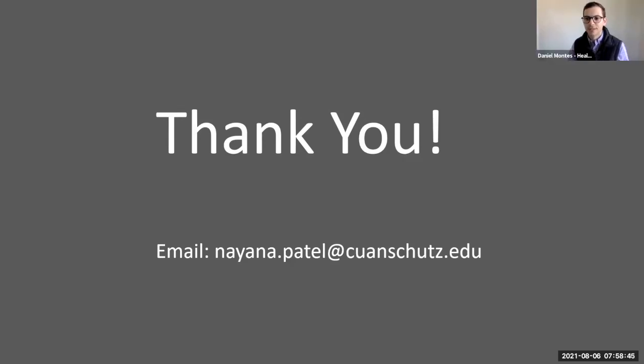Thank you. And the final question is, shouldn't we promote in-bore biopsies over fusion biopsies to retain the procedure with radiologists? That is a good question. There are some centers who are doing MR in-bore targeted biopsy, and there is evidence in the literature that they are more sensitive in terms of detecting clinically significant prostate cancer.